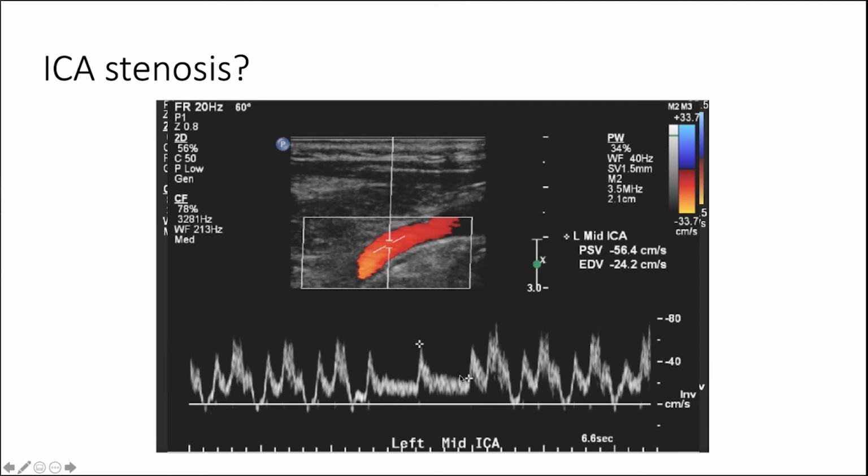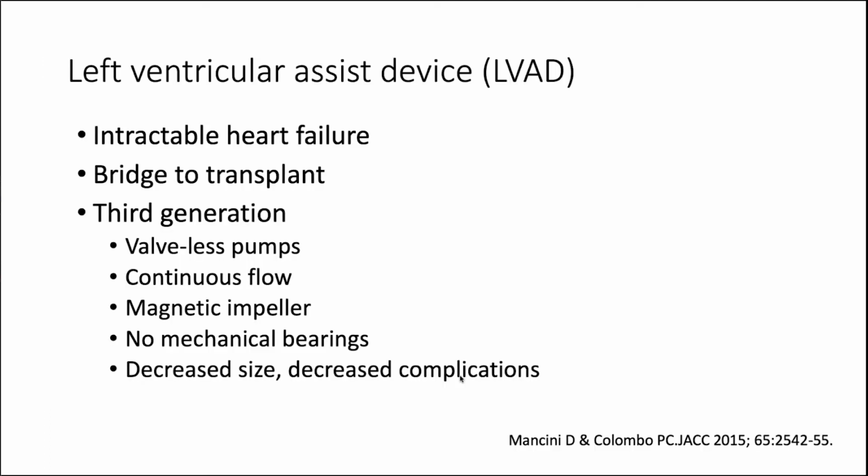Obviously, if the patient is heavily dependent upon the pump, you want to interrupt the cycling for as short a period as possible. I mentioned left ventricular assist devices, and obviously these are not in common practice everywhere in the world, but it is useful to know a little bit about them.